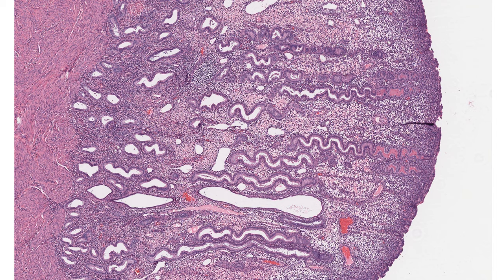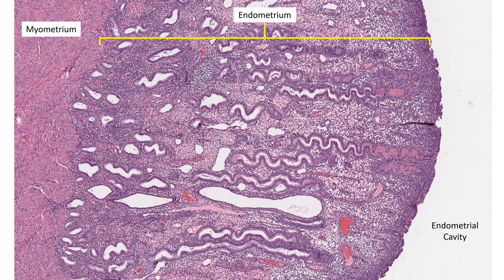Let's jump right in. Here we have a section from a hysterectomy specimen showing a nicely oriented portion of endometrium. On the right side of the screen is the endometrial cavity — the space at the center of the uterus lined by the endometrium. On the left is the myometrium, the thick smooth muscle wall around the uterus. The endometrium itself is split up into glands, and between the glands is the endometrial stroma, which supports and gives structure to the glands.